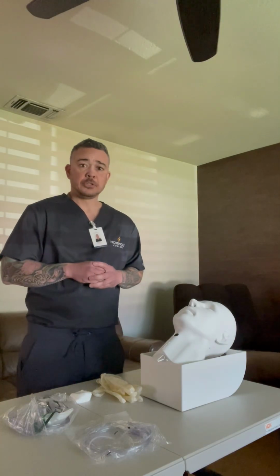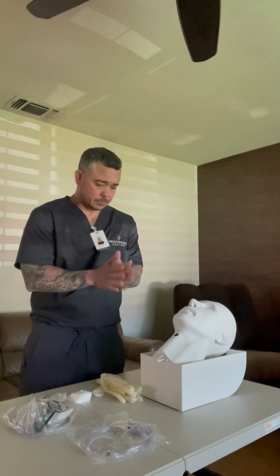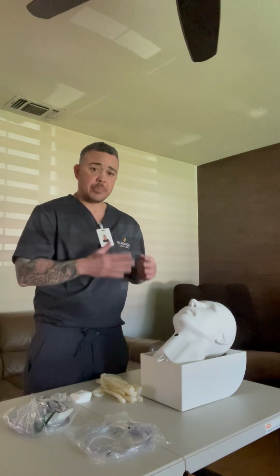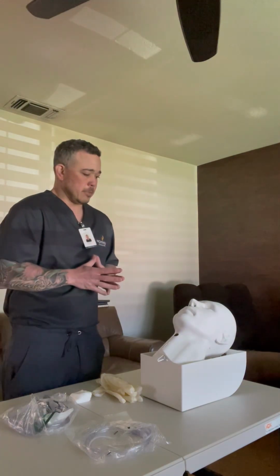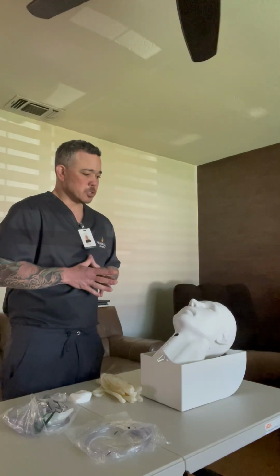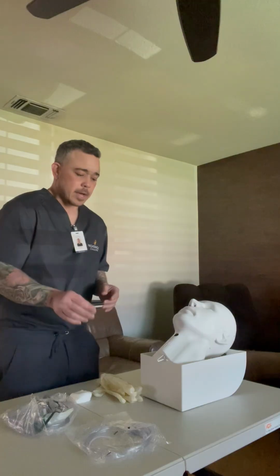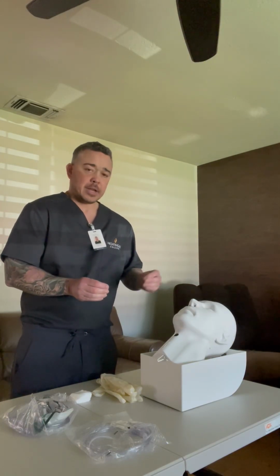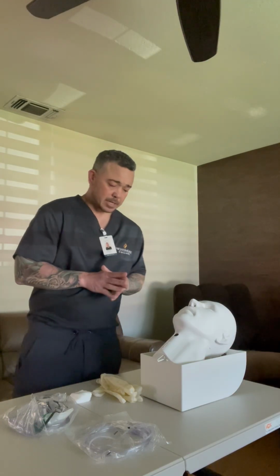Second thing I'm gonna go ahead and do is walk into the room and make sure I use proper hand hygiene. Okay. The next thing I'm gonna do is introduce myself to the patient and then ask for two patient identifiers. So hi, my name is Tristan, and I will be your nurse today. Can you please tell me your first and last name and your date of birth? Great. I would make sure that I check the wristband as well to make sure that the name and the date of birth match the wristband. And so it does, so I have my two patient identifiers.